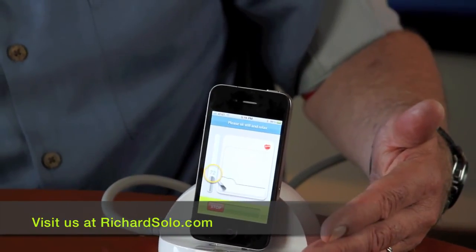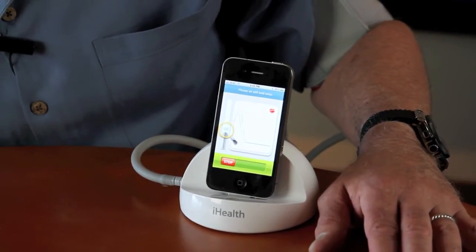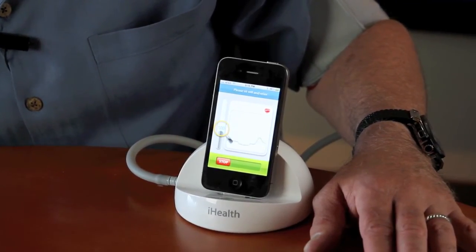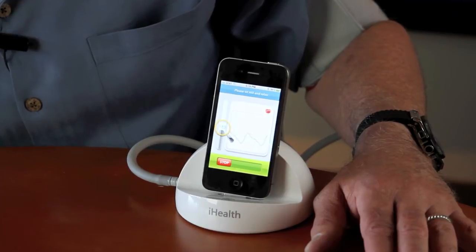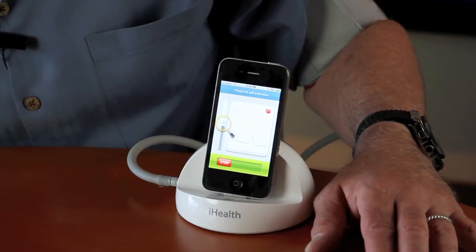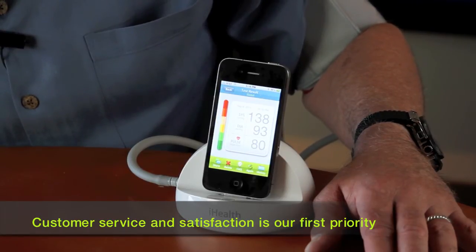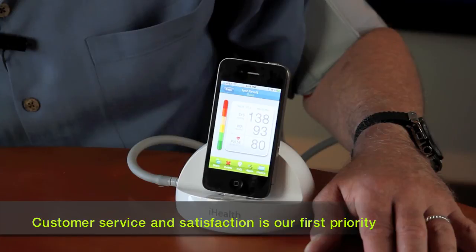But it's really clever, well-made, innovative, different, and the only one of its kind. I'm going to take one more reading here. I like the way you see the graphical interface while it's doing it — that's pretty cool. There you go: 138 over 93 with a pulse of 80.